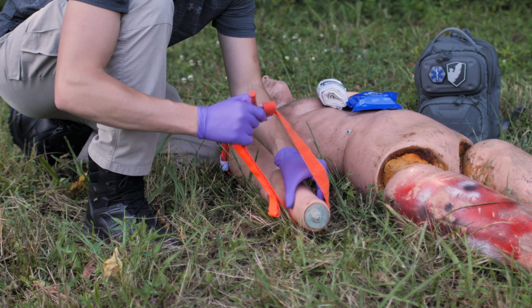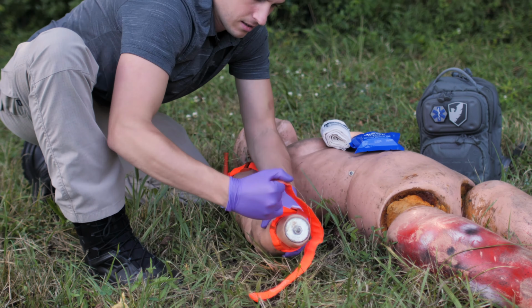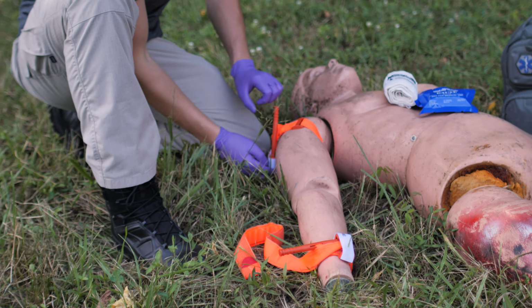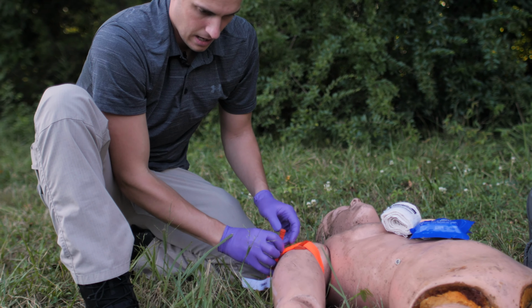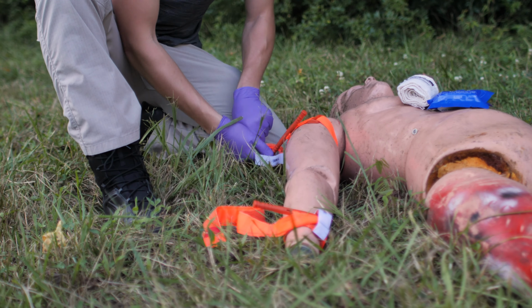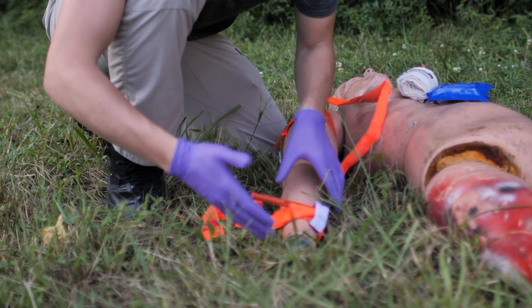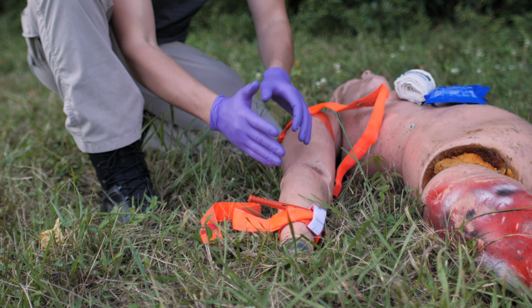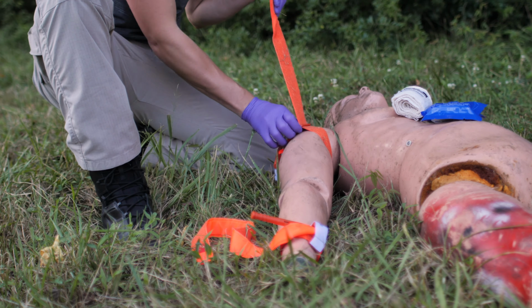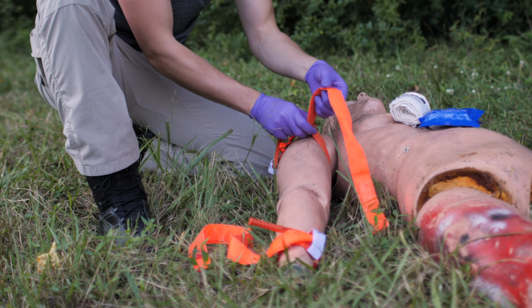We take our second one, 2 to 3 inches above the wound, tighten that down, lock it in, put this in here, tighten it. That's in place, and now I'm going to release this, and then I want to be checking this to make sure that this one is now tight enough. And then I want to reassess. I'm not going to take this one completely off until I reassess and make sure that this is fully stopped. Once I know this is taken care of, I can now remove this one, or I can leave it in place in case I need to tighten it back up in a minute.